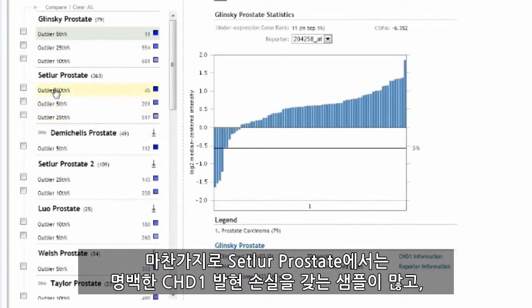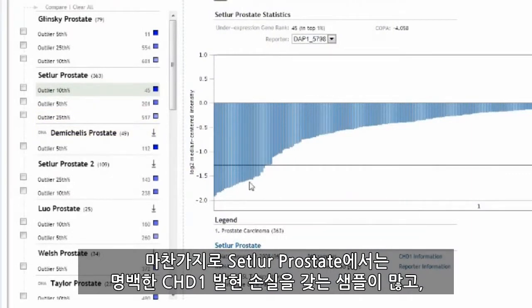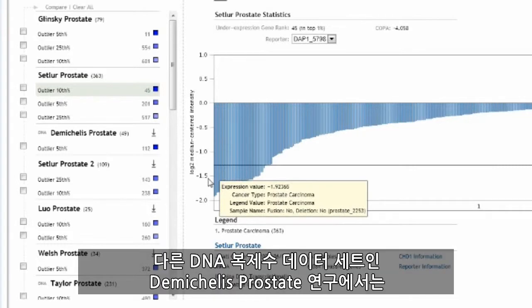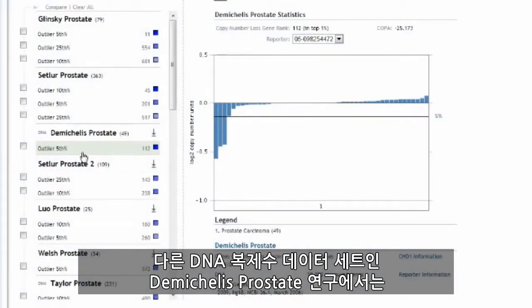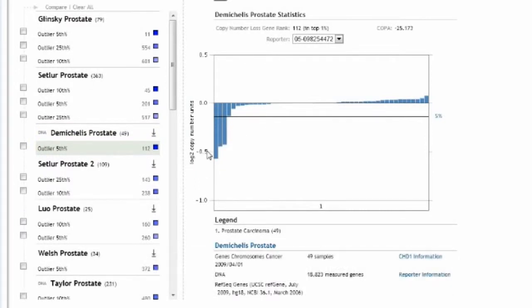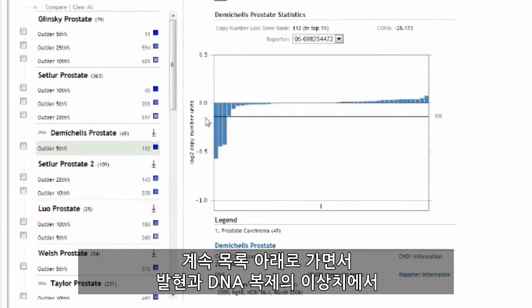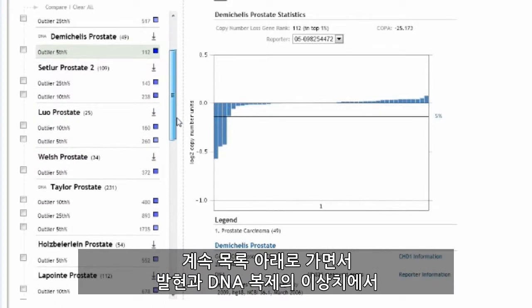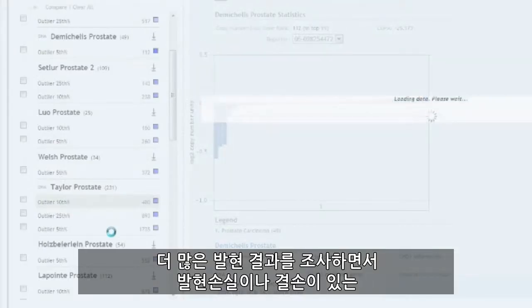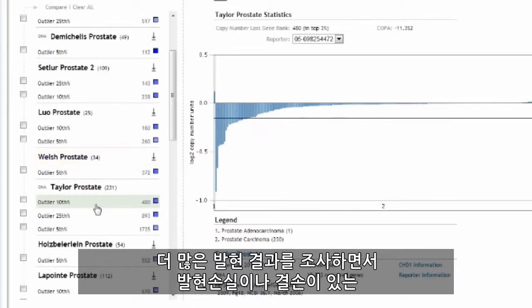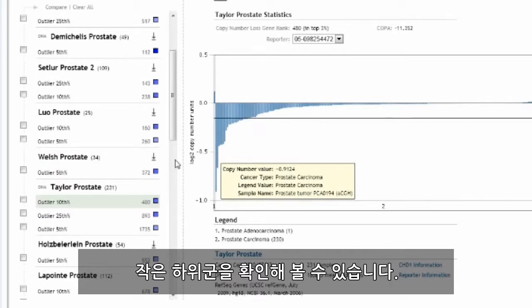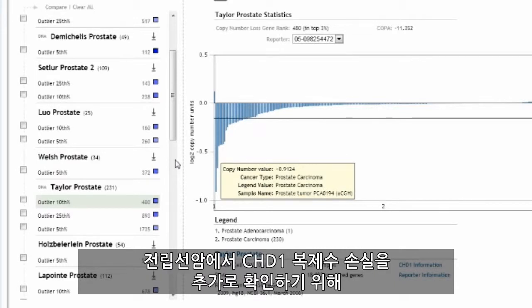Similarly, in the Setlur prostate study, we have a number of samples that have apparent loss of CHD1 expression. And in another DNA copy number dataset, the de Mitchellis prostate study, we have a loss in a subset of samples as well. We can continue further down the list, exploring more of the expression results in outlier analysis — both in expression and in DNA copy — observing the small subset where there is either loss of expression or deletion.